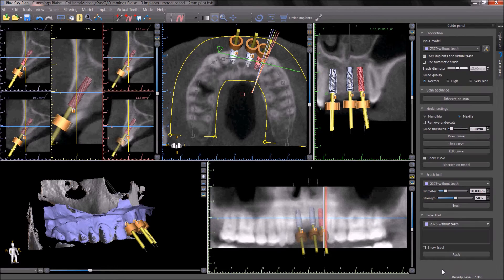The panel will now show the full array of options for digitally designed surgical guides.